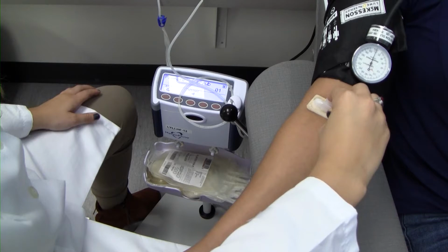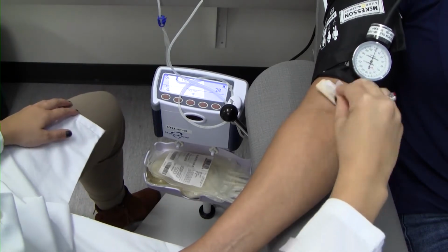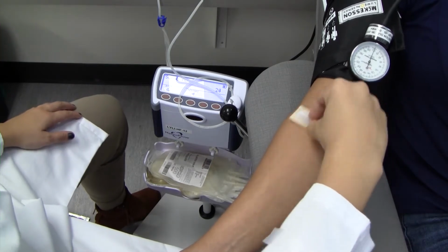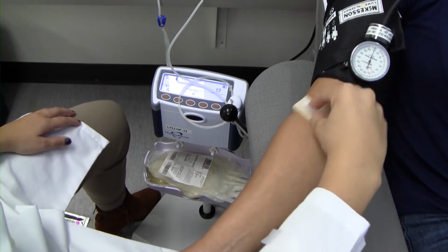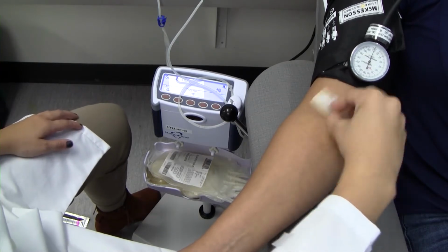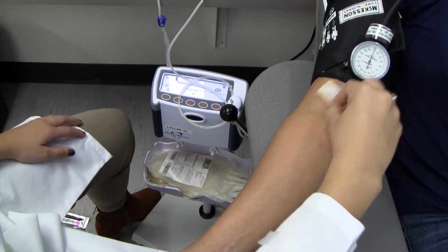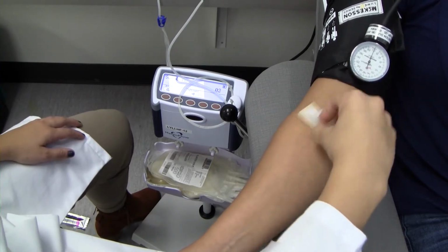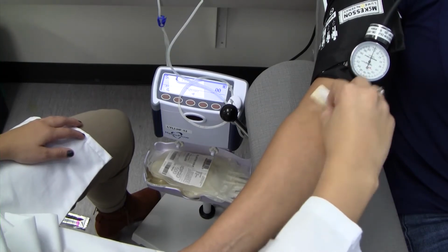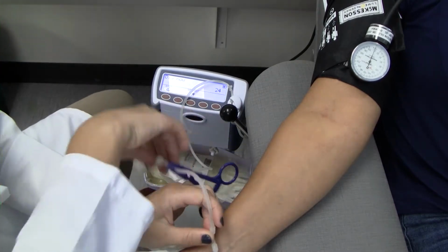When prompted by the hemoflow's arm scrub timer, gently move the applicator back and forth against the arm for at least 30 seconds, making sure to cover an area approximately 1 inch in every direction from the point of venipuncture. Allow the area to dry undisturbed for approximately 30 seconds. Secure tubing above the Y below the PPD to the donor's arm.